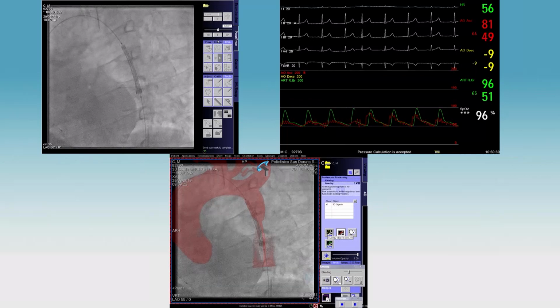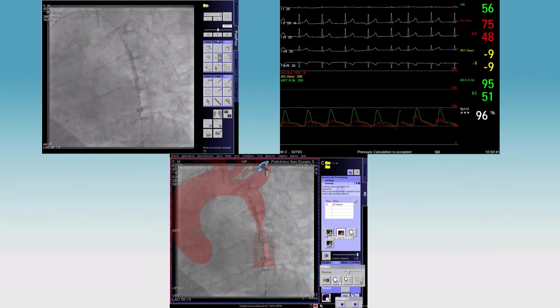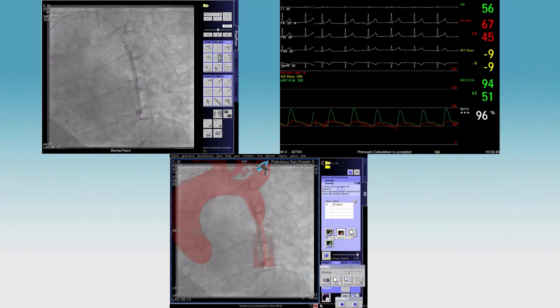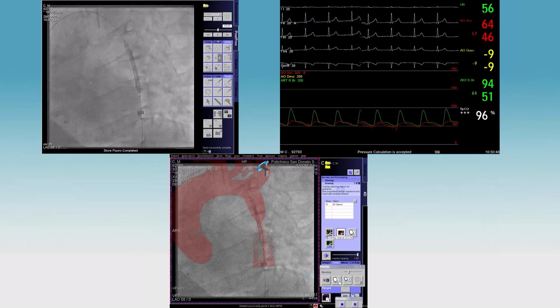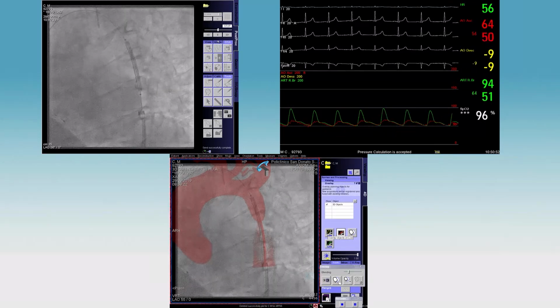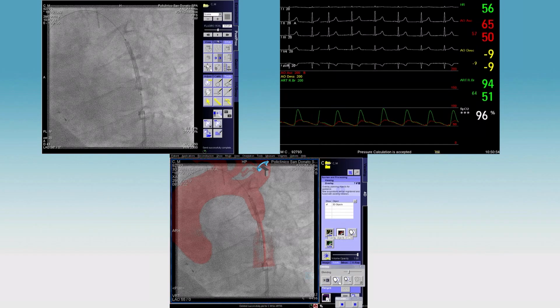It's so tight, I wouldn't worry about pacing. Just a little push up, just a little. Okay, so let's do one more angio, and then we'll inflate. Possible to do an angio? Yeah. Go.